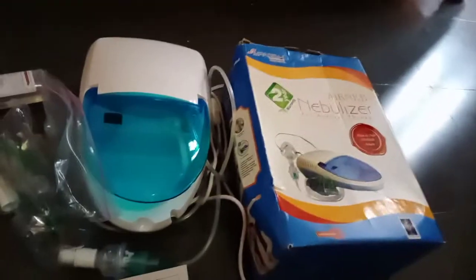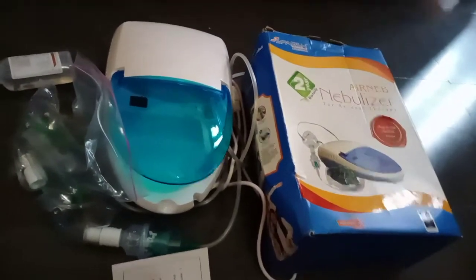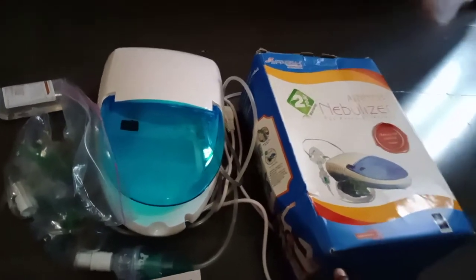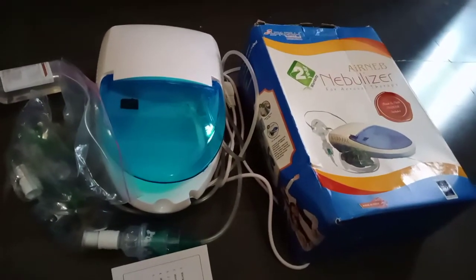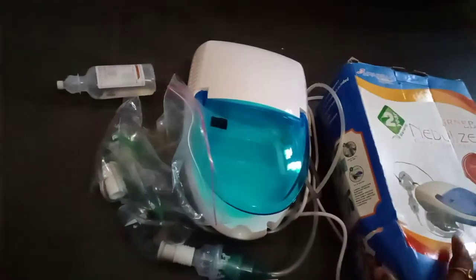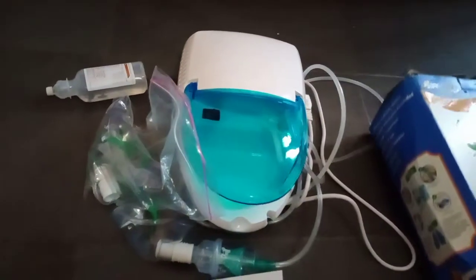Hello and hi everyone. I'm going to talk about the first nebulizer uses and review. Kids and adults are also included. There are many uses in rainy season and winter season.